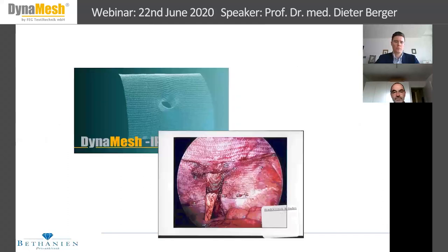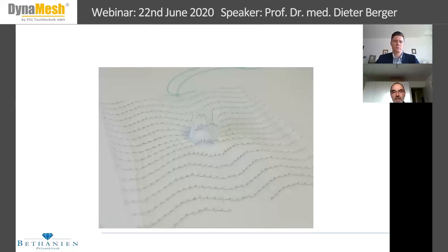Okay, this is the IPST, the prophylactic mesh, which should be mainly or exclusively used with a diameter of 2 centimeters, because it's elastic, and the length of the funnel should be 4 centimeters. This is the same one that can be seen in the MRI.